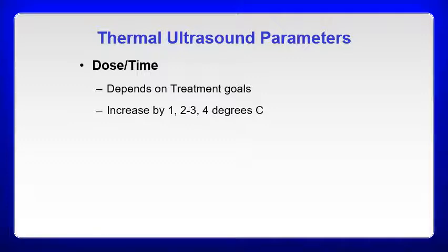So you're just trying to essentially, in the subacute phase, because obviously in the acute phase you don't want a temperature increase because of what's going on during the acute inflammatory events, but subacutely you could increase the metabolic activity and try to enhance healing. A 2 to 3 degree increase reduces chronic pain and spasm and increases blood flow.